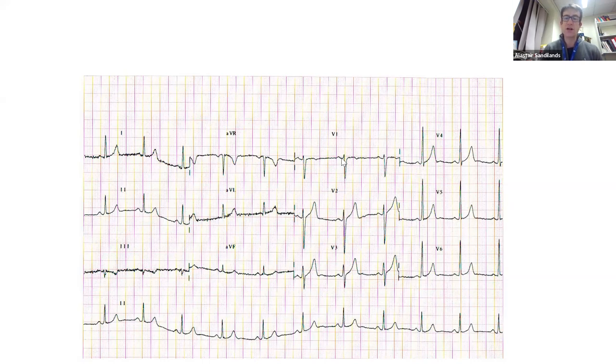Looking at the QRS, we've got an R wave that's very small at the start, and as we go across, it gets bigger. We have a transition complex at V3 because it's positive and negative together. And then V4, V5, V6 are all positive as we'd expect. So we have a normal R wave progression.